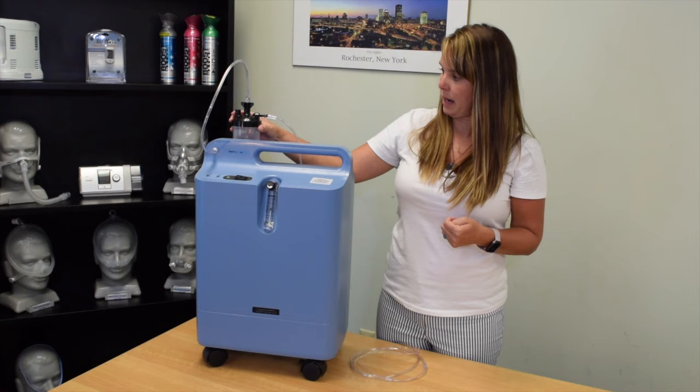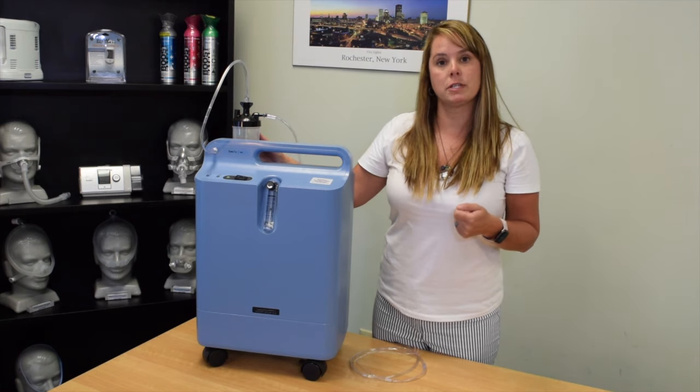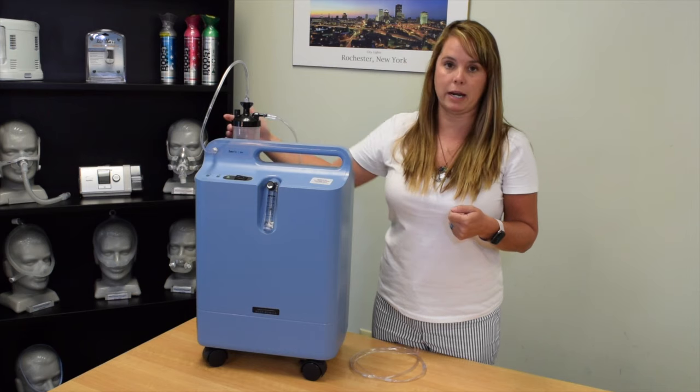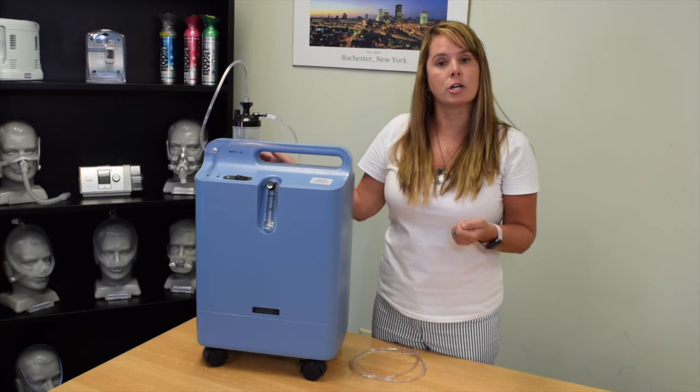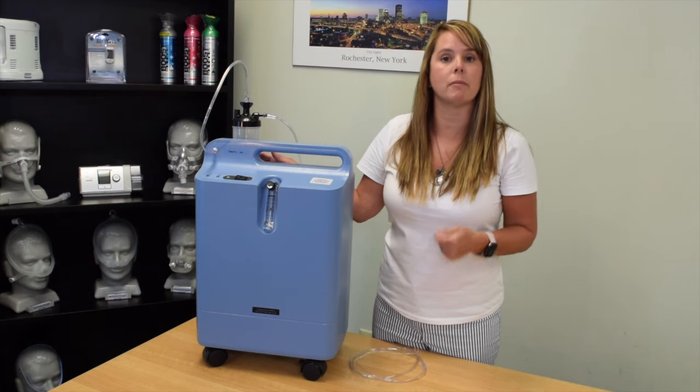If you're using the humidifier bottle and you feel that the flow is not coming out the end of the cannula, first make sure that it is threaded correctly. You can also put your cannula or tubing into a little glass of water and see if you experience bubbles there, because if you do then there is flow coming through that cannula.